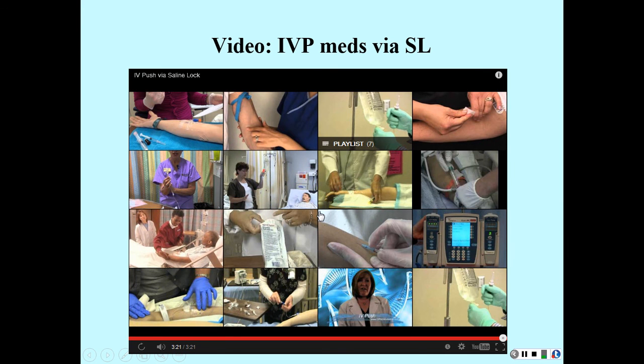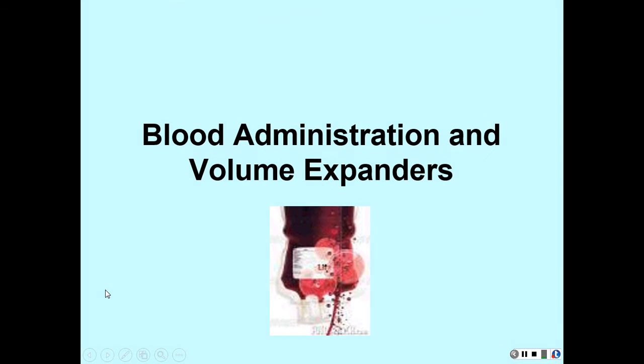Now, one of the things that they did was she cleaned off the site before she changed every time. If you can maintain the cleanliness of that hub, okay, you don't have to do that. If you can keep your hand on it, or just make sure it's not flipping and flopping and getting all in the bed covers, that kind of thing, it's okay. You don't have to do that.